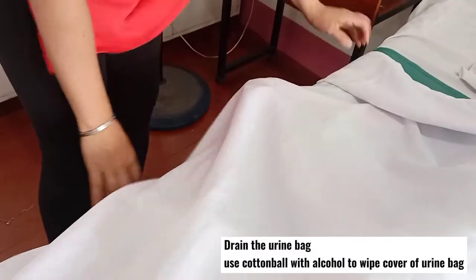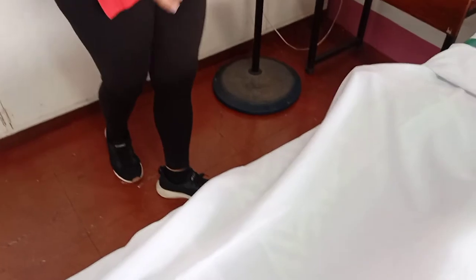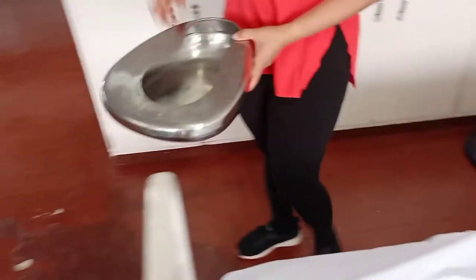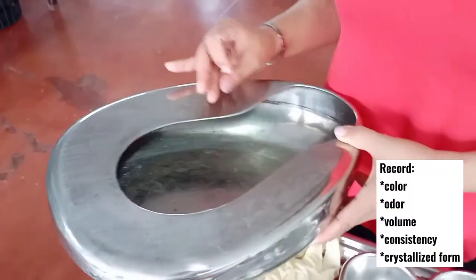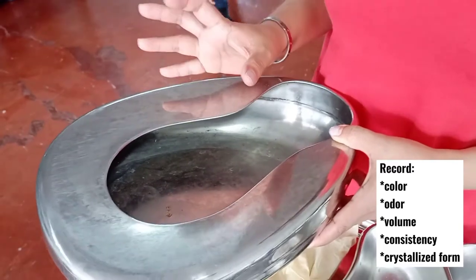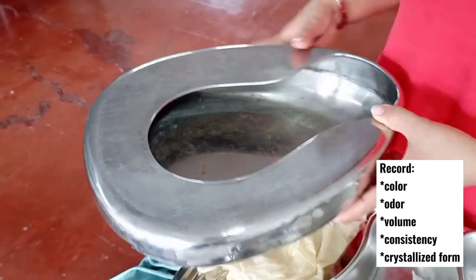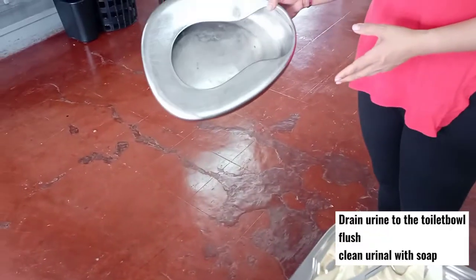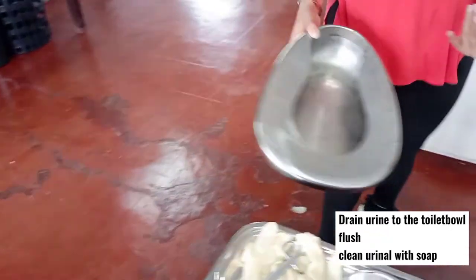Raise the side rail using proper body mechanics. Record the color, odor, crystallized form, volume, and consistency of the urine, then flush it in the toilet. Disinfect the urinal or bedpan and go back to the patient.